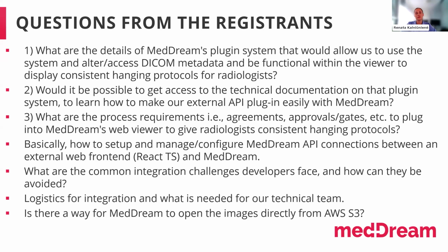Okay, another question: is there a way for MedDream to open the images directly from AWS S3? Yes, this is not the topic of this webinar, but in principle, yes, we have a dedicated AWS S3 plugin. You can find it in our installation manual. So it is possible to open studies directly from S3.